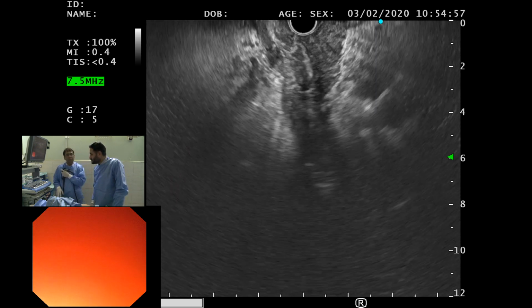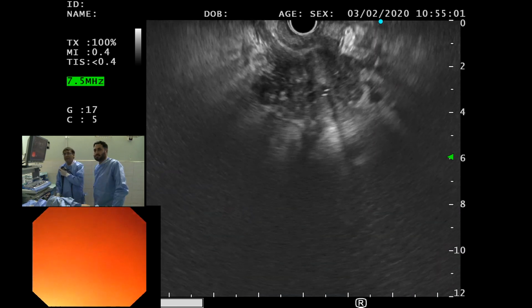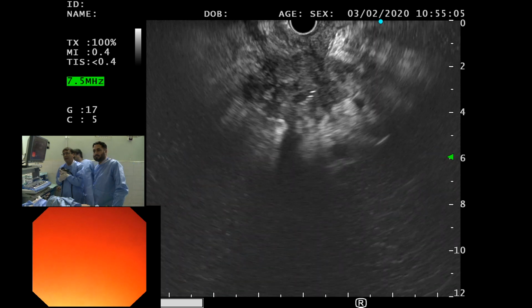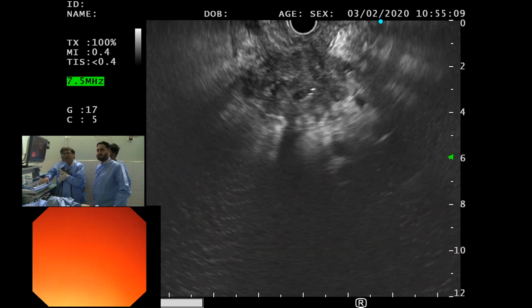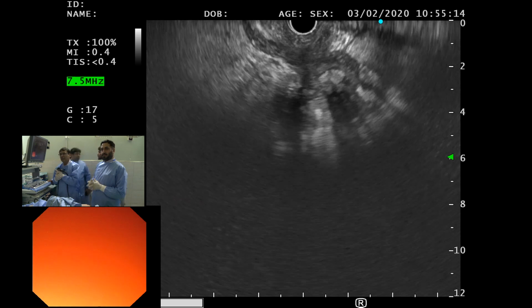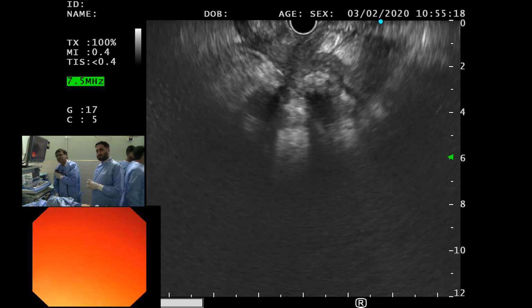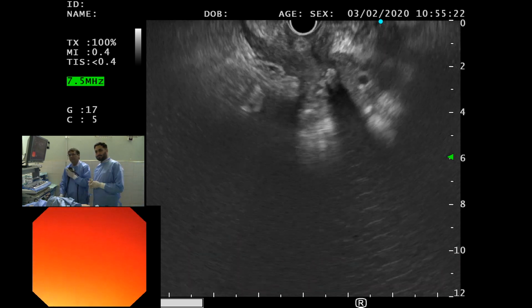I'll show it. You go ahead. So here, you see all that necrotic tissue, right? In the center, irregular. There's hyperechogenicity and echogenicity. And as you said earlier, the history is important too. And you see all this is necrosis there really. All shades of gray, all shapes, and white.